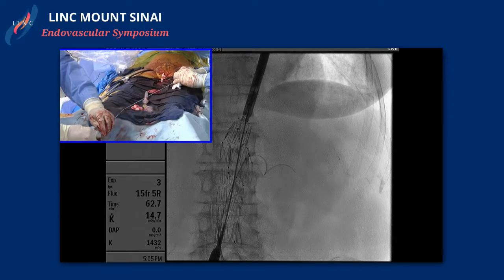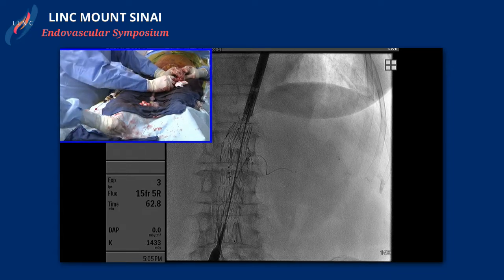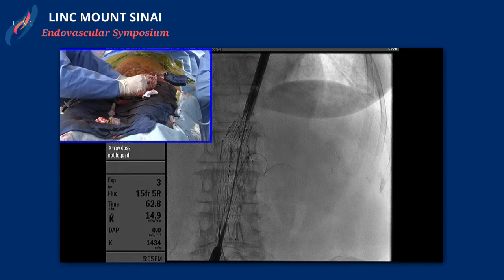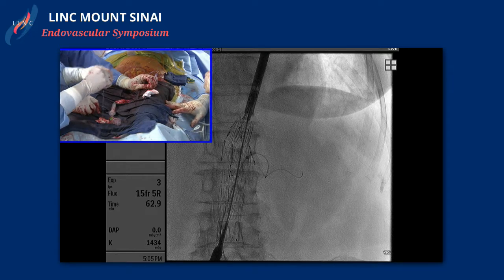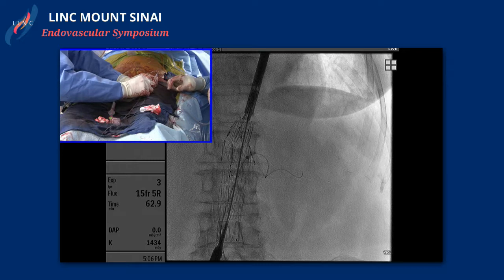I think this is kind of building support as you go. I did leave my Amplatz wire in and I've stuck the sheath — the 20 French sheath — just because I couldn't quite get the 25 centimeter sheath to get into the graft itself. So I'm using the Amplatz to kind of hold my position. I've got one sheath in. Once I get the second sheath in, I'll be a little bit more comfortable that I've got a good foothold in this. Now you're bringing up your trailblazer to switch out to a more supportive wire? Right. This should give us a nice, lubricious catheter to go through that area. I've got it supported with a sheath behind it. Everything's straight. Don't let it bow.